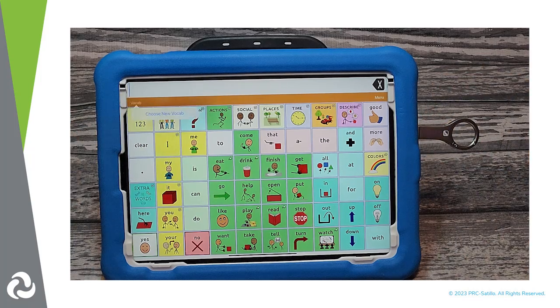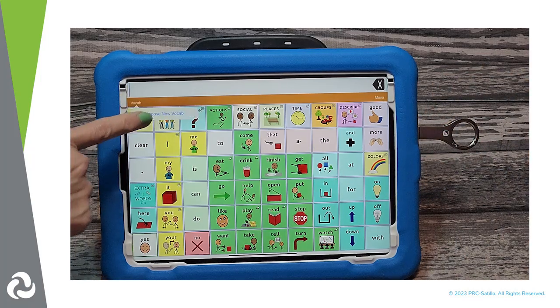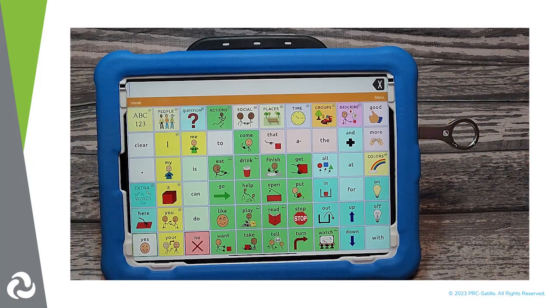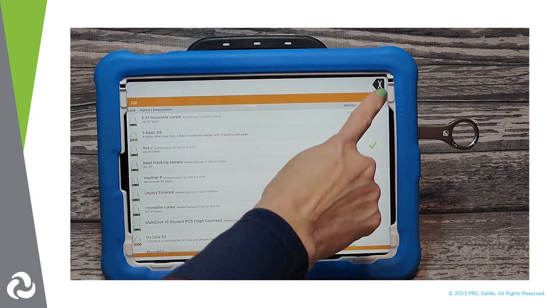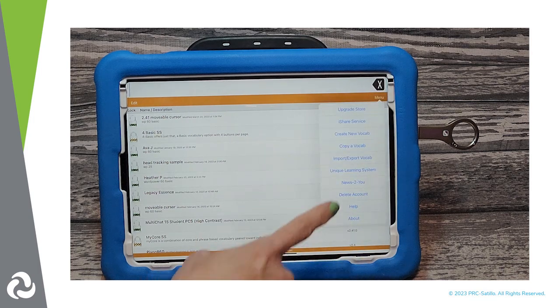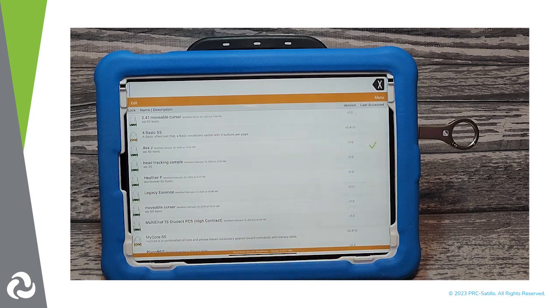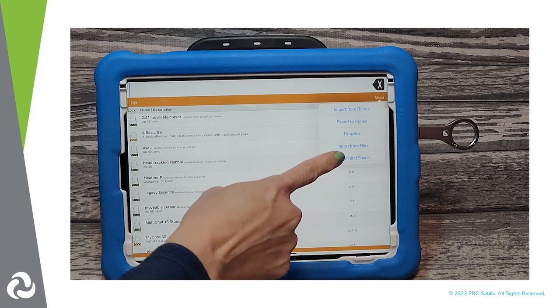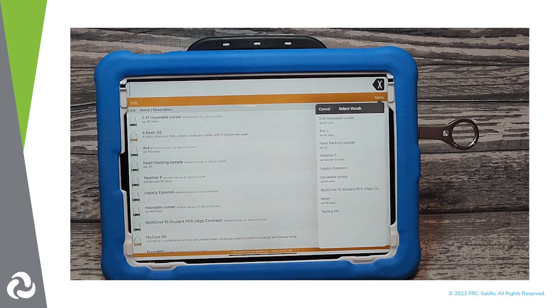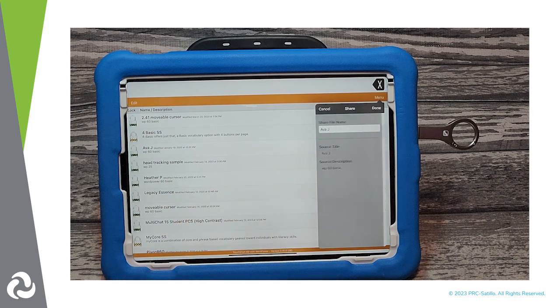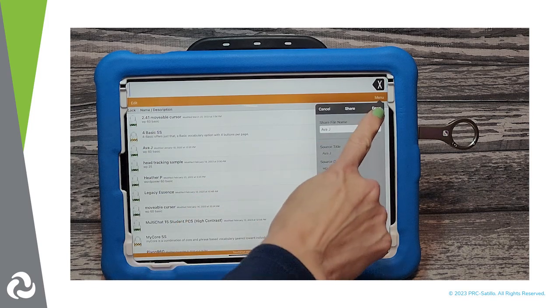Next, tap on Vocab, then choose New Vocab. Tap on Menu, then Import-Export Vocab. Select Export and Share. Choose the file you want to back up. You can rename the file and then tap on Done.